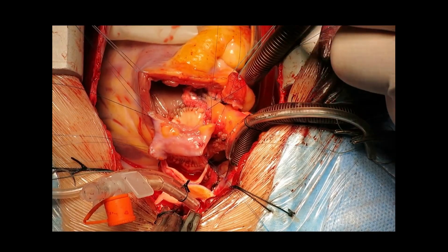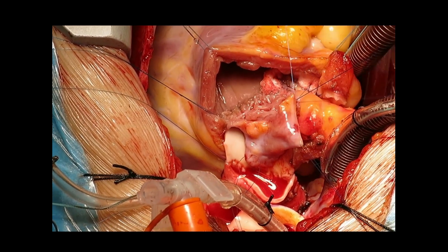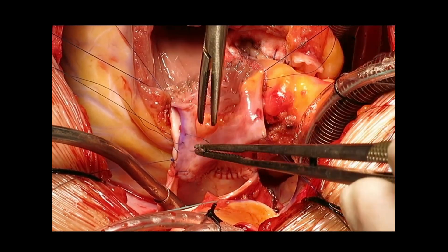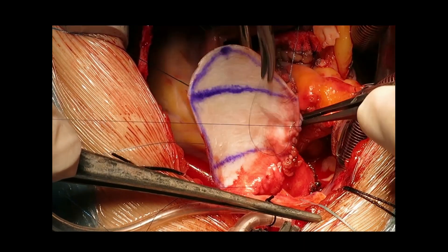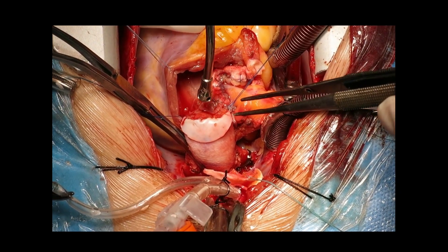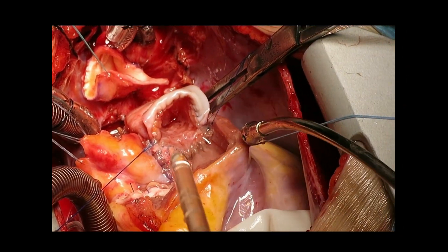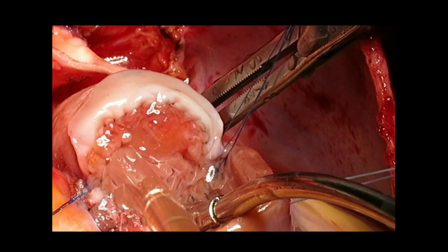The rest of the RVOT construction is completed similarly to tetralogy of Fallot repair: first anchoring the posterior annulus, then the lateral commissures, and finally creating the anterior wall with a tailored bovine pericardial patch. When we test the valve with saline injection, observe the perfect leaflet coaptation. From below, looking from the ventricular side, you can see the perfect, relatively symmetrical closure of the leaflets.